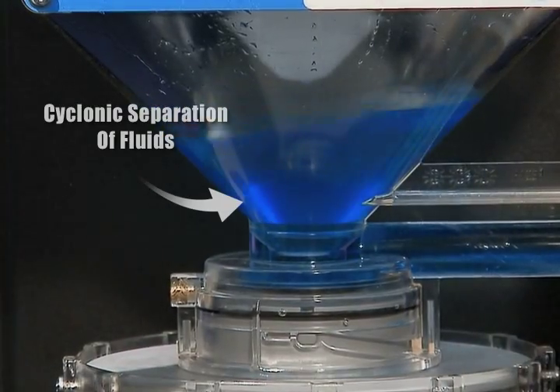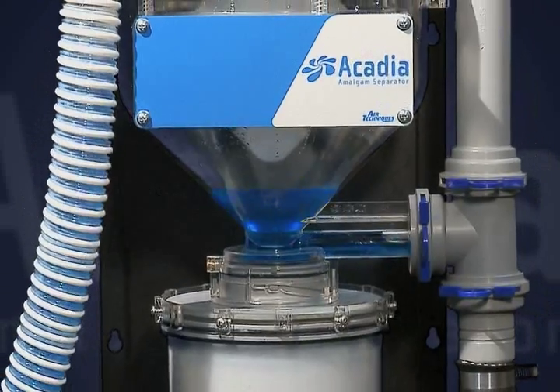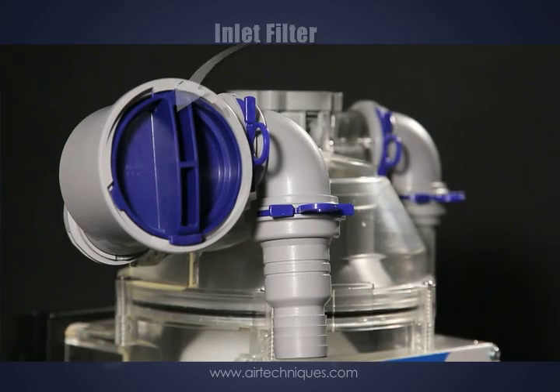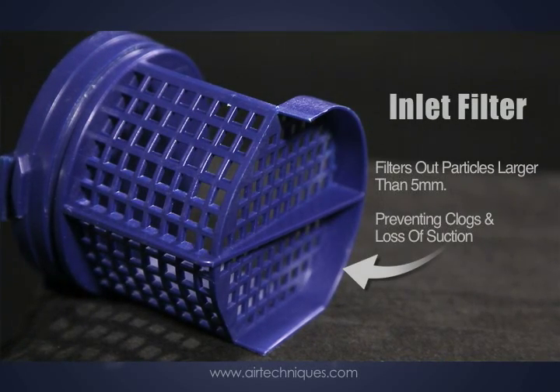The translucent container enables you to view Acadia's cyclonic separation of fluid. The Acadia's inlet filter ensures a smooth and continuous filtration process. Particles larger than five millimeters are filtered out, preventing clogs and loss of suction.